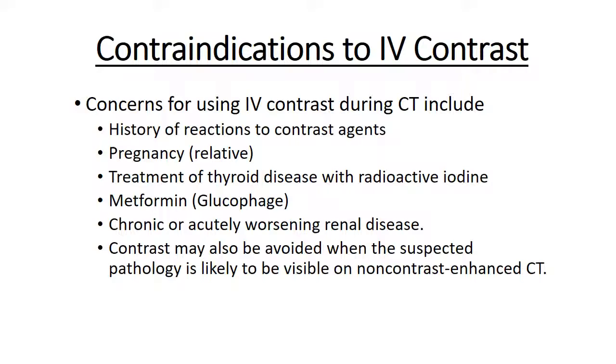The other thing you can do is try to help keep the person hydrated well before, during, and after the scan. So you can give IV fluids before you give them the scan with the IV contrast, and then give them lots of fluids afterwards as well to try to help flush that through their system and help their kidneys clear it quicker so it doesn't sit in the kidneys causing nephrotoxicity. Also, if the patient already has a nephrologist who sees them, you could also consult with the nephrologist to see if they have any recommendations and if they're okay with you doing the contrast.